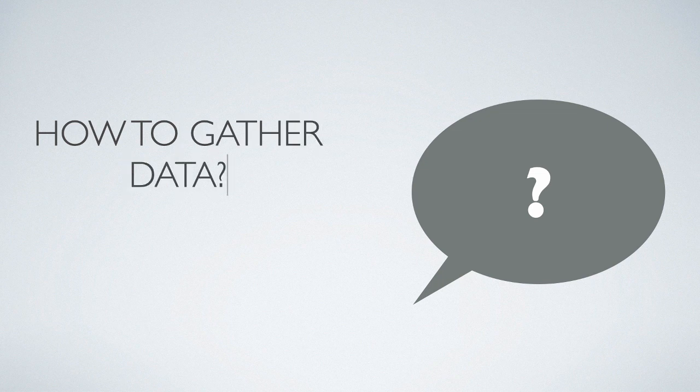Our final hypothetical researcher is a group leader whose research group has been conducting TMS EMG experiments for years.